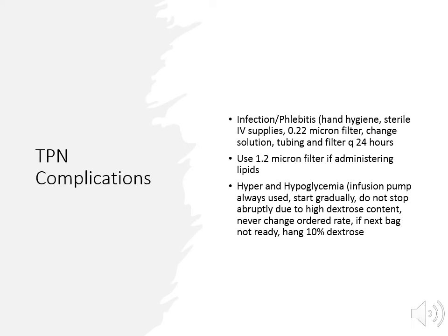The fat globules cannot pass through a 0.22 micron filter. So if the lipids are administered and there is no filter available, they must be connected below the filter. You can check in your trace book for filter sizes.